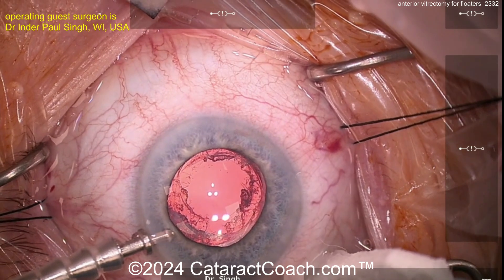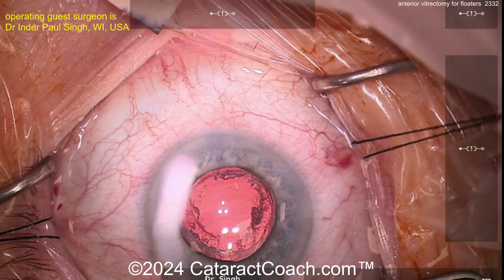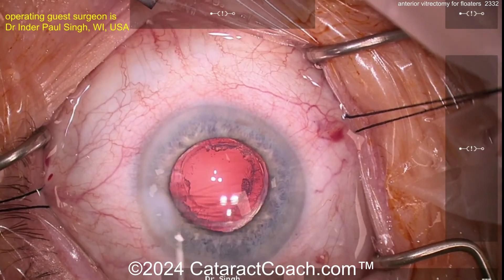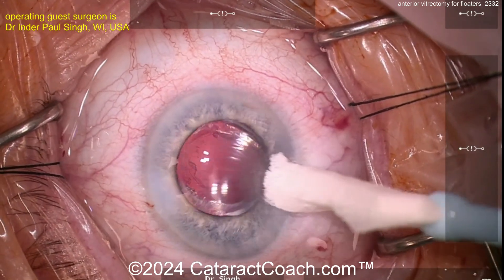Bringing the infusion down and taking out the AC maintainer, making sure there's no leak — which is good. These are small 27-gauge needles so they don't leak. I'm going to hydrate the anterior chamber, hydrate the wound, fill up the anterior chamber with some BSS on a stick. That is it — patient did great. Hope that helped everybody!